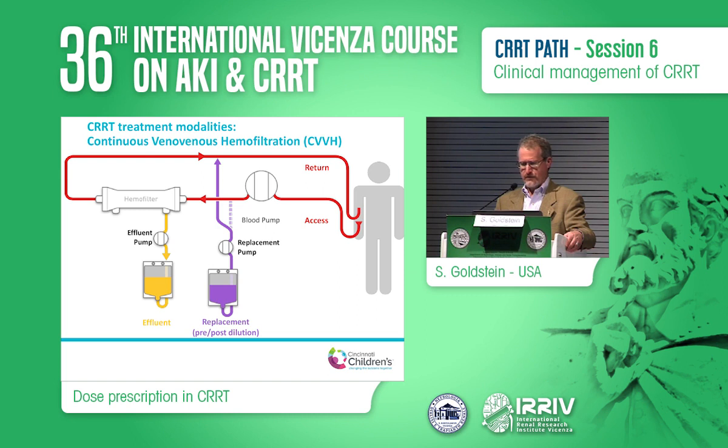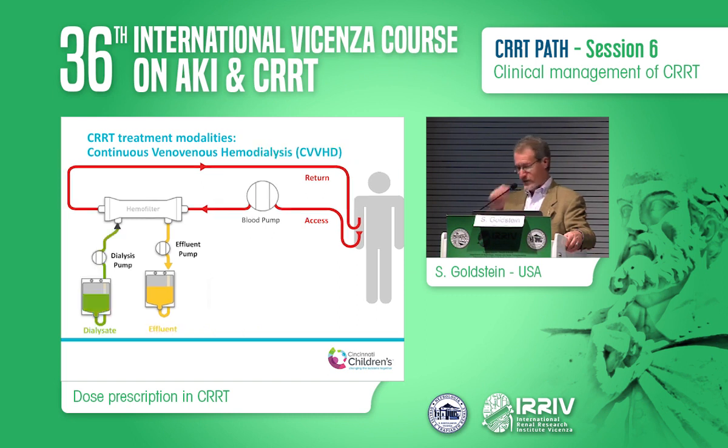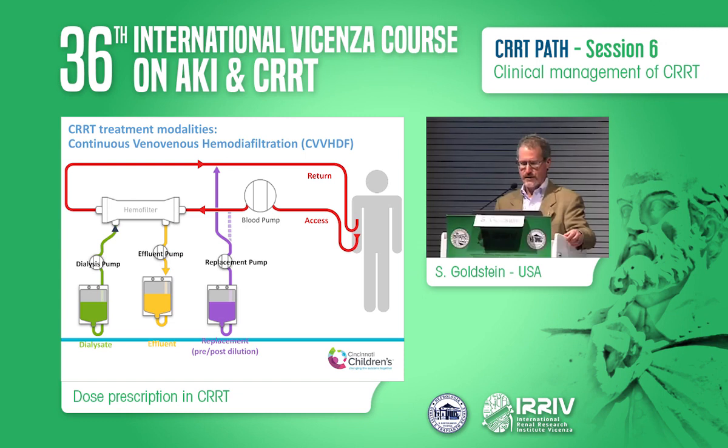In continuous veno-venous hemodialysis, again, we have countercurrent dialysis flow as well as the addition of effluent volume from ultrafiltration. And then if we use both, we can take advantage of both modalities.